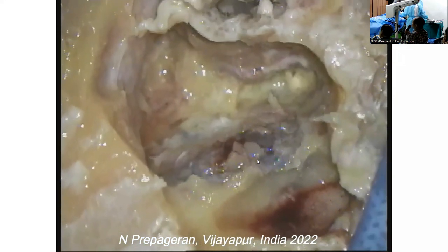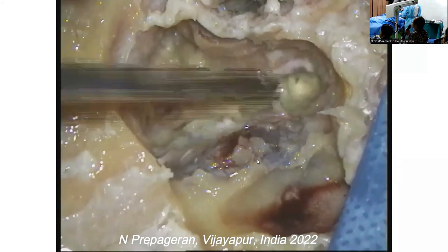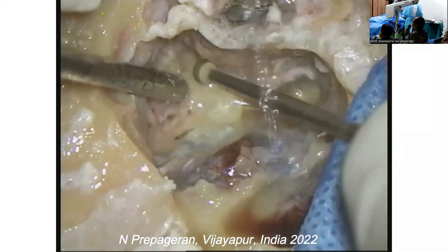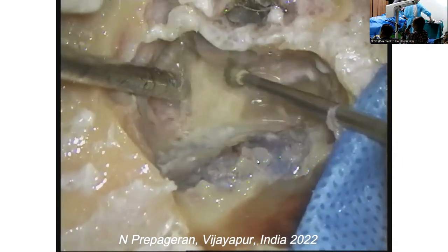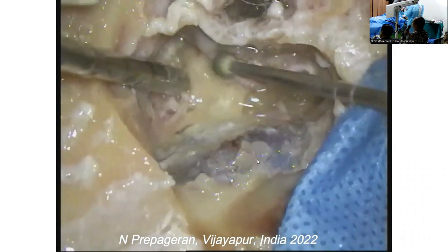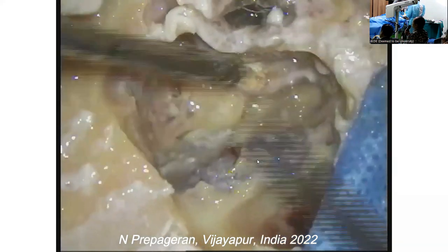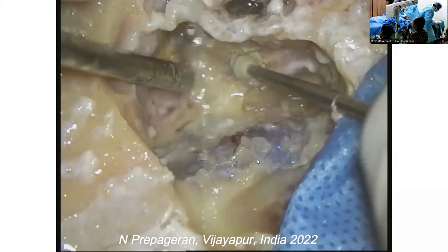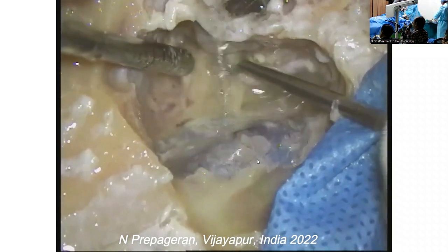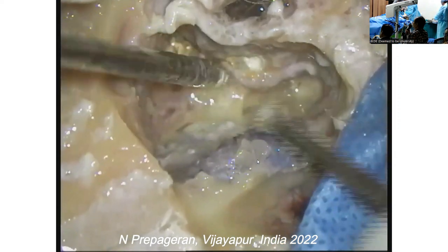Hey guys, can you see so far? I'm now going to go into the middle ear space already. Go above the facial nerve and you go into the middle ear space. So thin all this, and I'm going to go into the middle ear space now. Is rerouting the facial nerve mandatory in all cases? No, we've stopped doing that for a long time already.